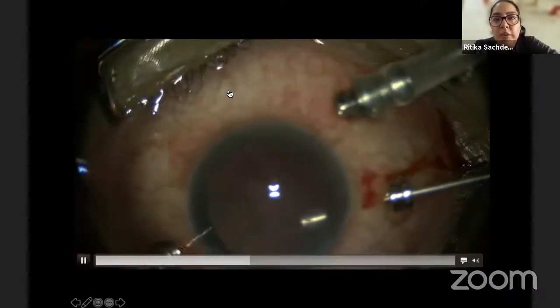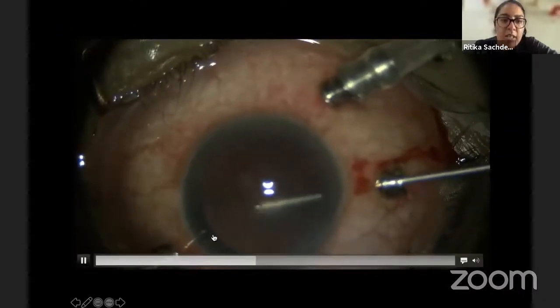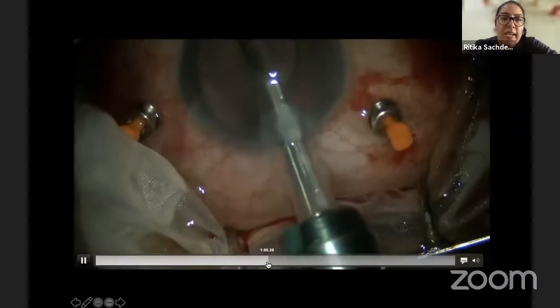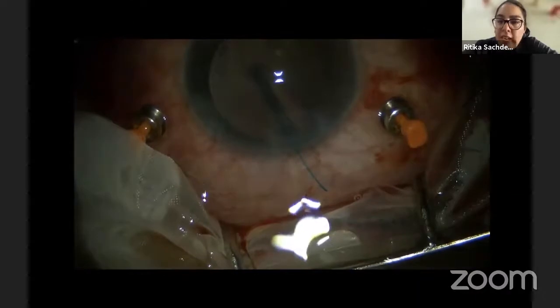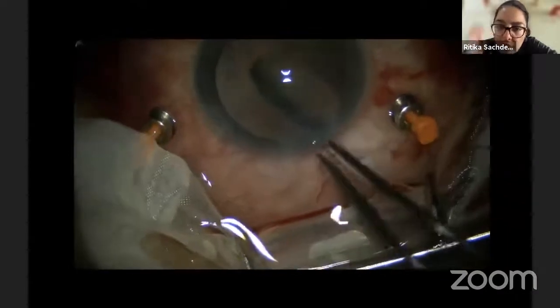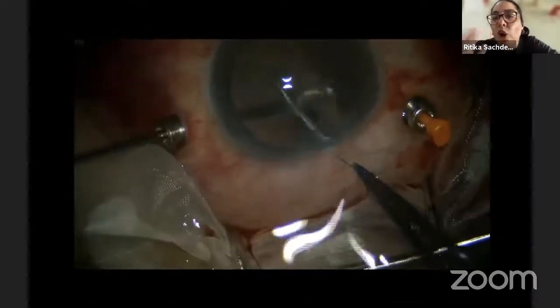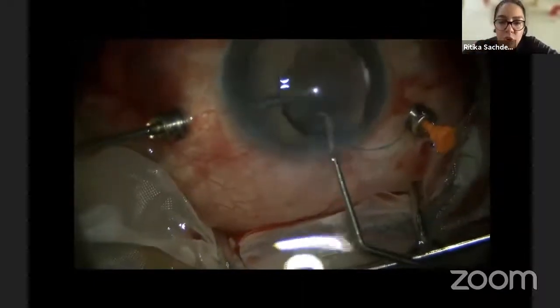Again, this is a vertical rip and a three-piece IOL would be positioned well here. I'd just like to highlight again, please be cautious while putting a three-piece IOL. Either implant it over the iris and then dial it in, or you will have to keep one end dangling out to ensure that though this has vertically dropped, it has still not dropped into the vitreous, because you have access to one haptic which you can latch onto.